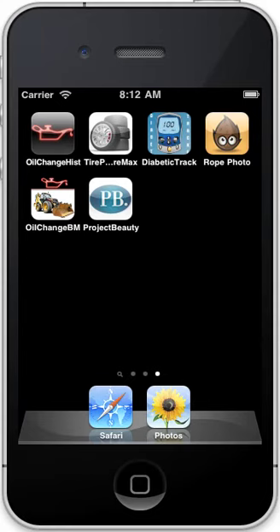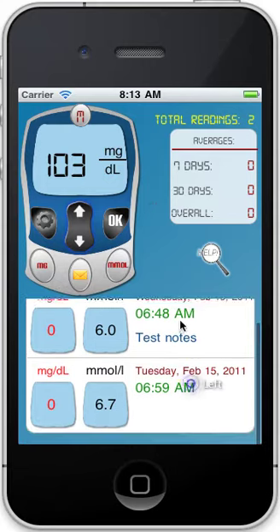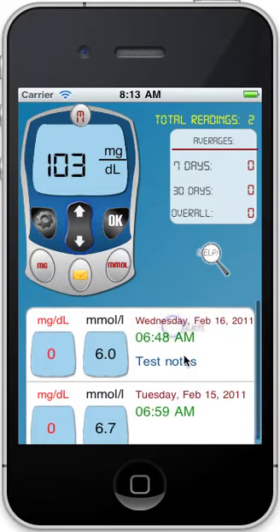Hi everyone, welcome to the Diabetic Tracker Unlimited demo by DashyApps.com. Let's get started. There's our new version, and in this version we have a list of all your history right in front of you, right on the main screen.